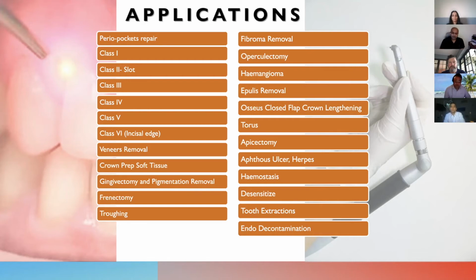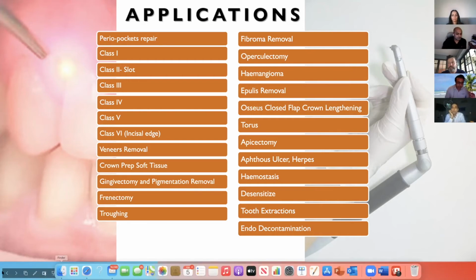Sorry, I just want to expand on that. Is it just better healing, a quicker healing, or does it take the pain away as well? It takes pain away as well. And there are two things, Senthil. As soon as you're doing the treatment, the pain is completely shunted away. It blocks the pain for the patient. The reason it blocks the pain is that it blocks the C fibers, the non-myelinated fibers. It's a whole journey of how it does it, but in simple terms, it blocks pain for the patient.